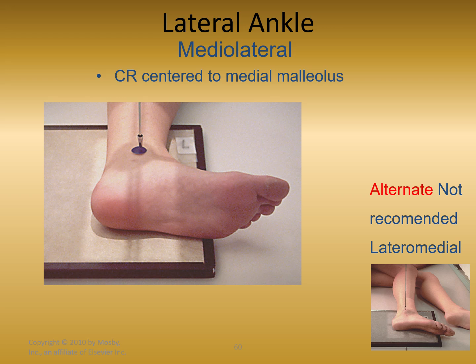So now let's look at the lateral ankle. All right, center ray is to the medial malleolus in this position. We want to include more tib fib in this image than we did in our lateral calcaneus. And I only say that because I don't want you to confuse the lateral calcaneus with the lateral ankle if you're shown pictures of a person in position for one of those x-rays. So be very aware of the center ray placement.